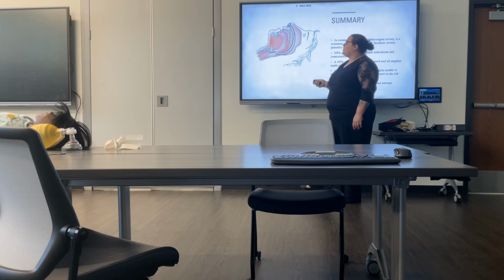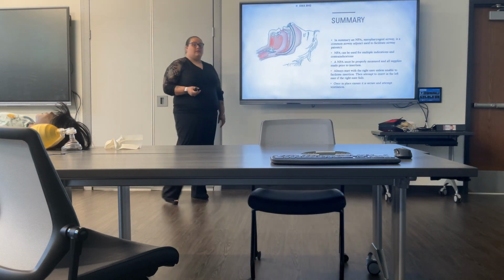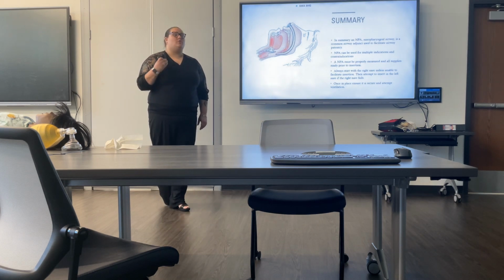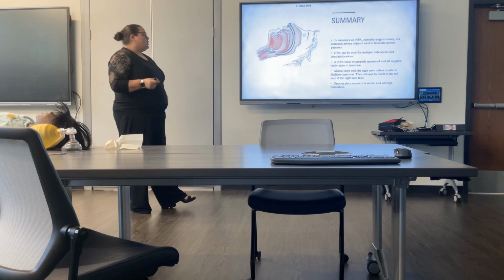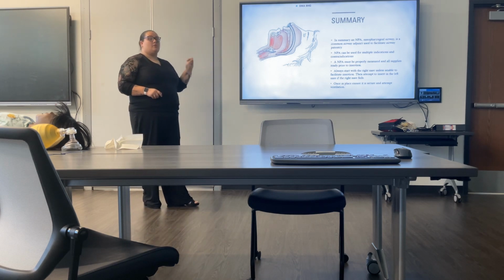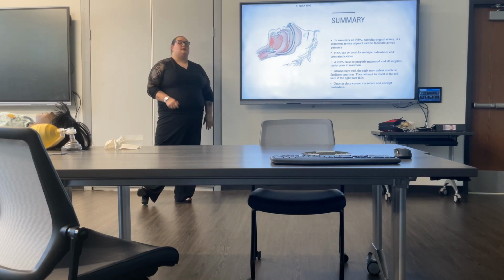You're wanting to make sure you're aggressive with airway management and proactive and not reactive. Airway management is the number one part of patient assessment, so you want ABC. So you want to make sure your airway management is super proactive and not reactive. You need to be aware of your patient's airway. And that is the nasopharyngeal airway.